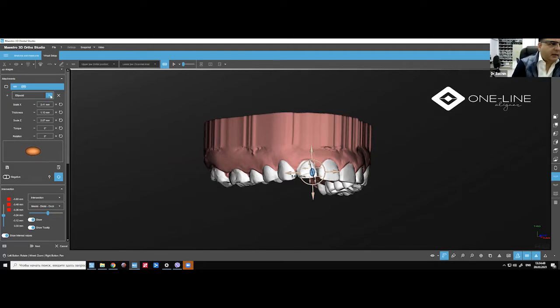But the one I like the most will be, as I said, the optimized root control. And I'll just go back to the shape which was before. So when you actually move it like this, you're giving the direction on the mesial side to go inside. Sometimes some people use it like this. Not my favorite position, but this is a good place to go.